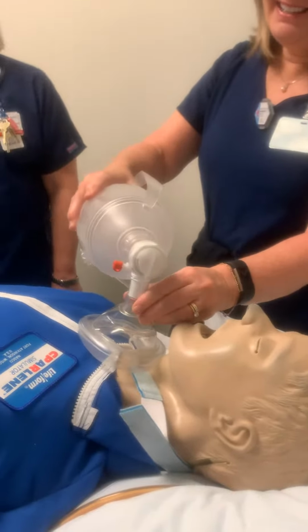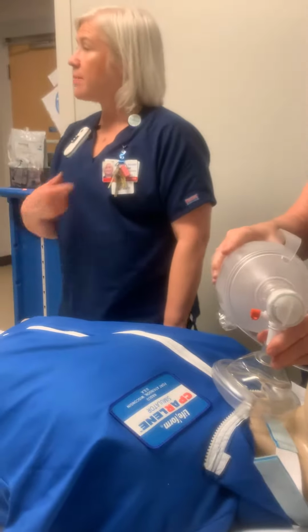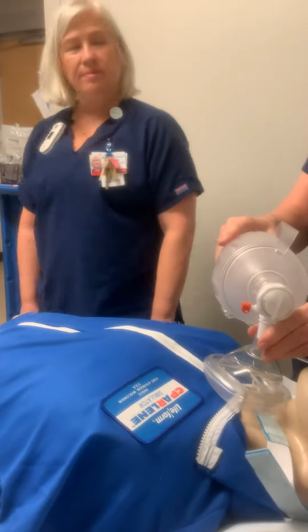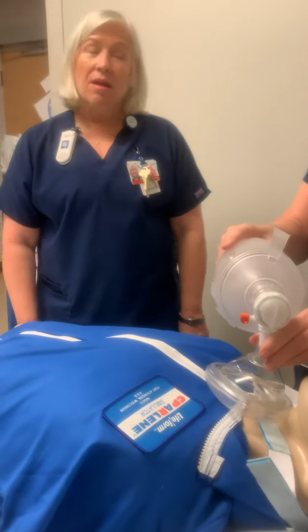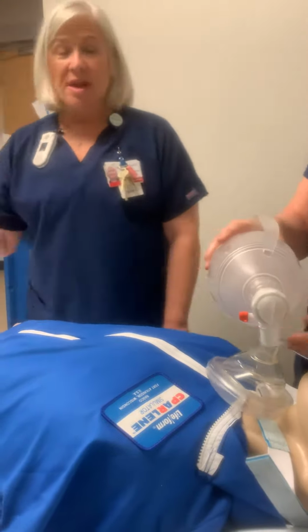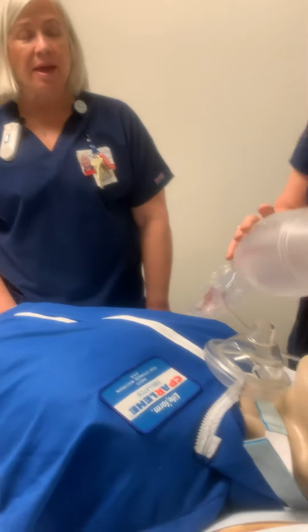And send somebody to get our doctor. Yeah, and you wanna notify that physician and see if they'll come in and put it back in. So SWAT would be the first one to call. Yeah, call SWAT. Okay. Yep. They're certified, but none of those guys are certified at this point. We did have a couple that were, and actually I think Deb Dompier was certified, but I don't know if she'll put it back in or not.